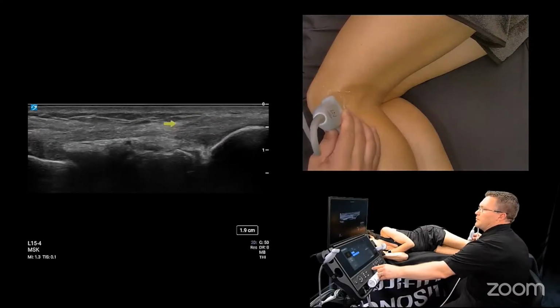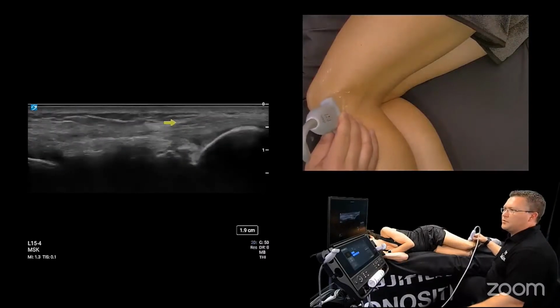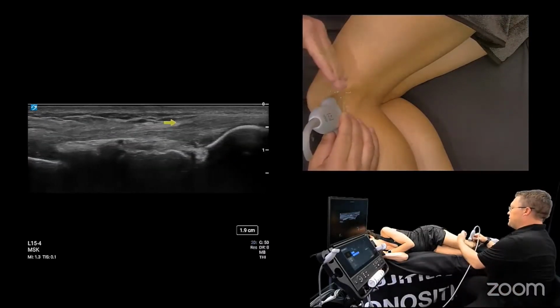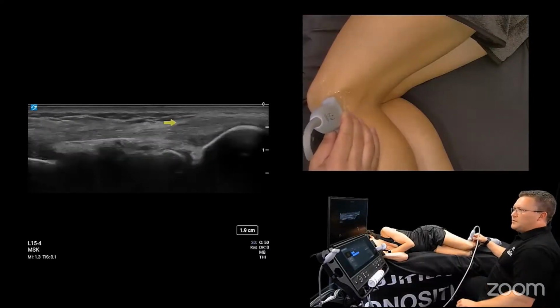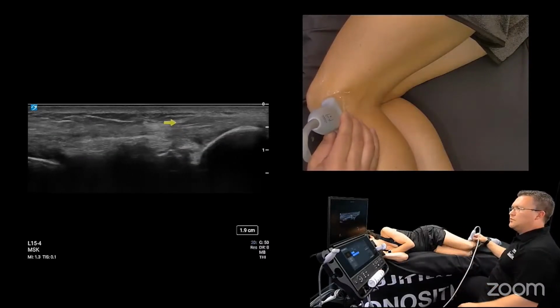We're gonna focus on that just real quick because it is a scanning pitfall. If you don't know it's there, you're going to call that some sort of pathology. So what I'm going to do is just pan the transducer from posterior to anterior, posterior to anterior. Do that in small 1 centimeter segments until you rule that what we're looking at is a cross section of something coming in and out of view.